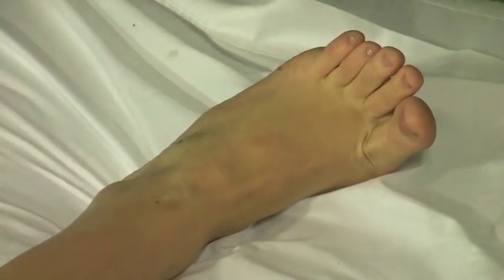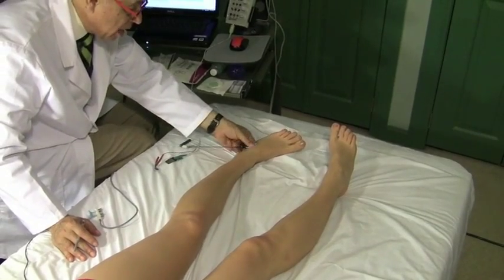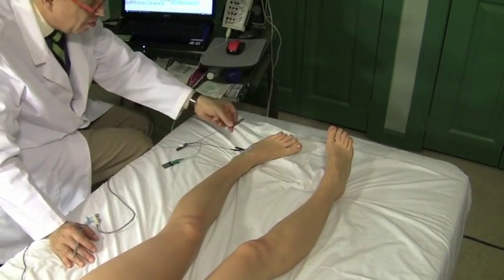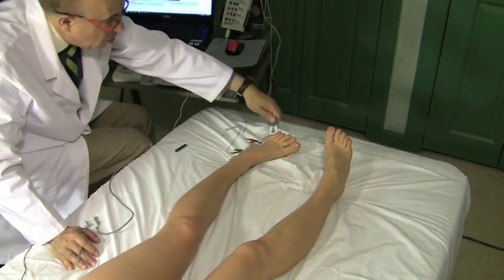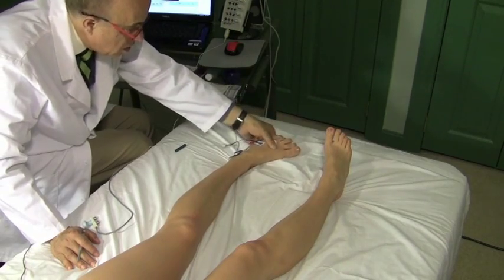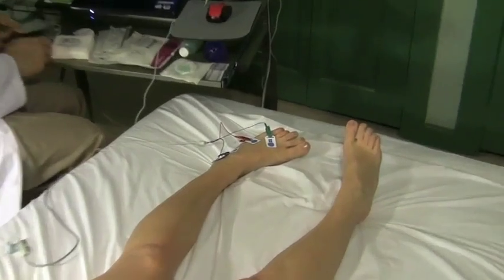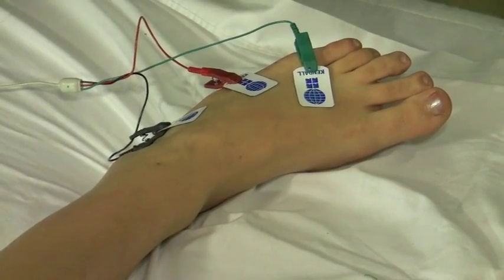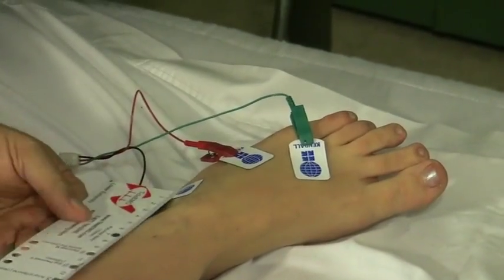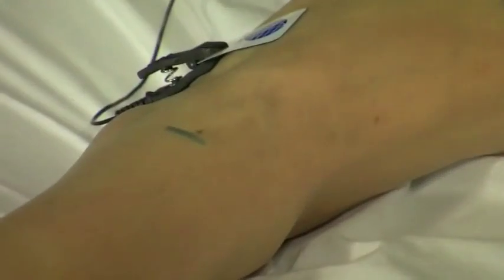I just place an X over that, and that's where I'm going to place the black electrode to record from it. That's the black electrode. That's the active, okay? Then I put the reference over a neutral area, and I put the ground here out of the way. And now I need to measure the distance that I use to study the peroneal motor. The peroneal motor, I measure it at 7 centimeters, and I put it from here. The peroneal motor is really in the middle of the ankle, somewhere here. So I place this here.